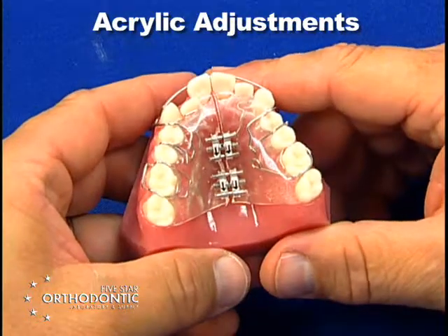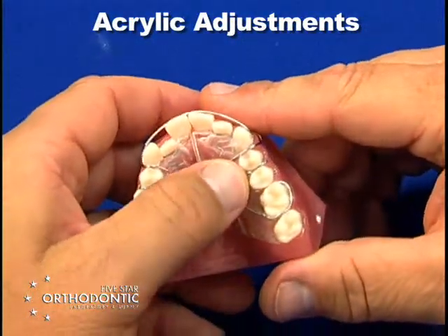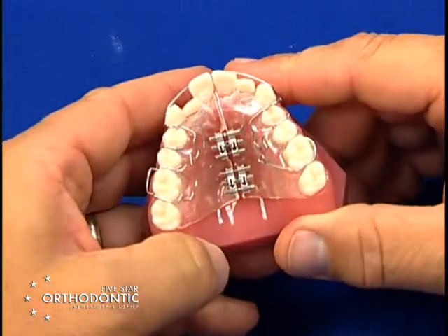Acrylic adjustments. As a patient wears the appliance, you may incur occlusal interferences.